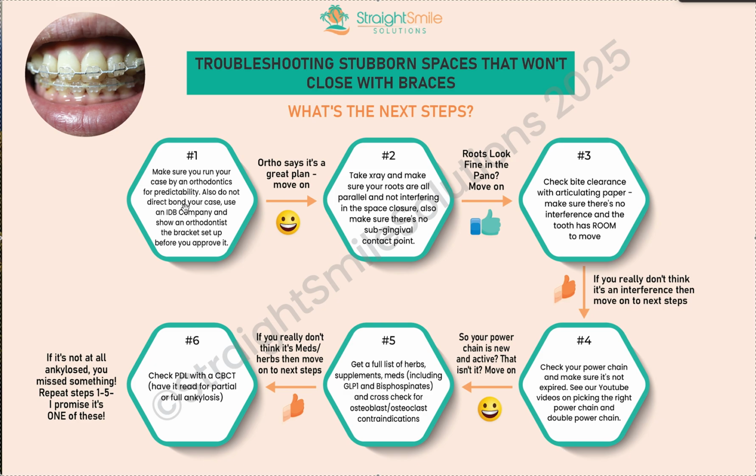All right. Number two, ortho says your plan is good. Brackets are put on right. Let's move on. Take some x-rays. Make sure your roots are all parallel and not interfering in the space closure. If one tooth is a little tipped, sometimes the space is not going to close. Also, there's something called subgingival contact points, and that is where the shape of a tooth maybe is more bulbous towards the gingival, and sometimes it looks like there's a space, but it's actually not a space.